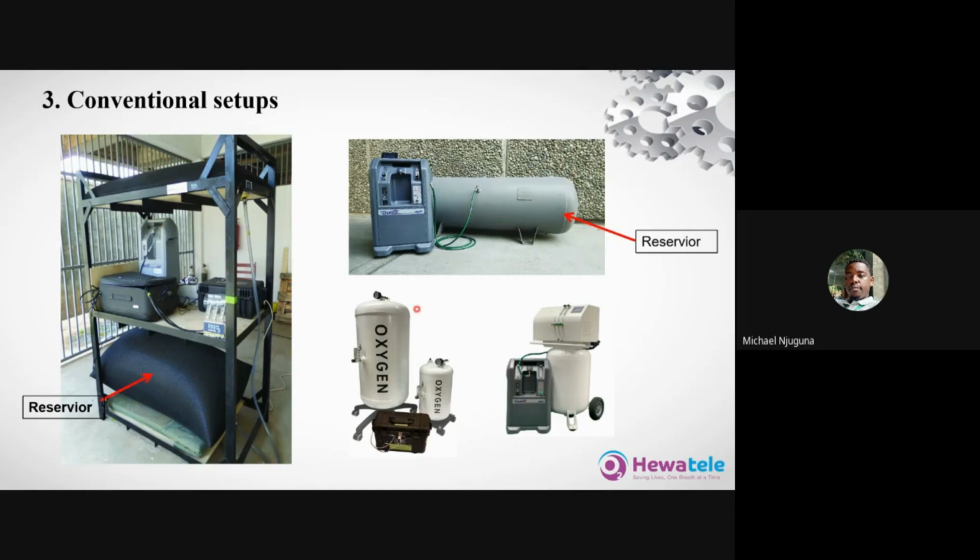That part has been bypassed and attached directly to the reservoir, just to get the reservoir filled at the right operating pressures. So here at the bottom, we have two types of LPR. This is a Biomedical LPR, which we will also be using in this session for illustration purposes. We are not marketing any brand, but just for the sake of illustration, we will use the Biomedical brand. So these are two reservoirs. One is big, of course. This has more storage capacity, and this one has less. And this is the filling station, which is between these two vessels.